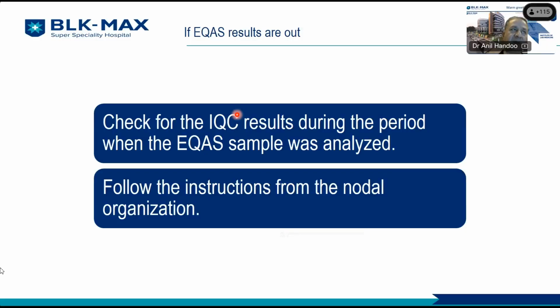For example, in one of our analyzers, which we had started in one of our newer hospital laboratories, we had a fluorescence channel. We ran a sample in the fluorescence channel and we got a certain value of platelets, and we put that value in the AIMS PT provider's result sheet. What happened to us is we failed twice. Every time the results were not right.